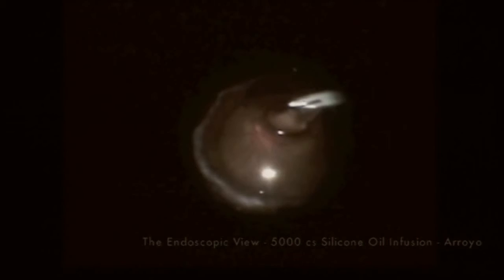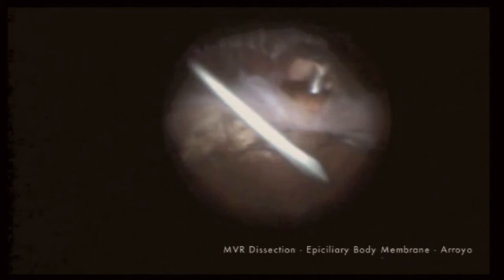Another group of patients who have benefited greatly from the endoscope are patients who develop postoperative hypotony due to epiciliary body membranes. In these cases, not only does the endoscope allow you to visualize the problem quite well, but it allows you to treat it either with the vitrector or sharply dissect it with the MVR blade or dissect it with the vertical forceps, as seen here.